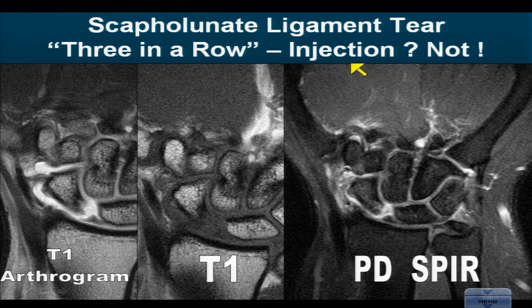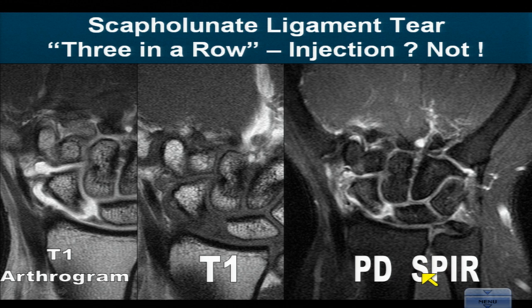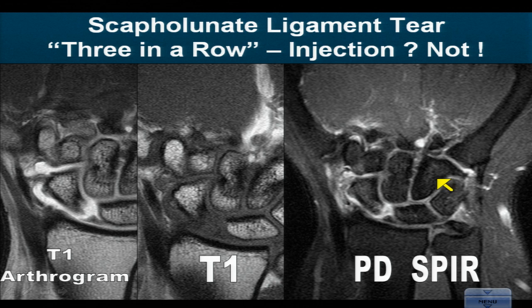The proton density SPIR — the heavily water-weighted sequence — demonstrates the same phenomenon. For non-MR practitioners and clinicians, don't worry too much about the names of these sequences. On a fat-weighted sequence, fat is white in the bone marrow and tissue signal in the joint tends to be dark. On a fat-suppressed sequence, the bone marrow fat is very dark, giving extreme sensitivity — you look at it more or less like a bone scan, looking for bright areas or hot spots, such as synovial inflammation or fluid along the margin of the scaphoid.